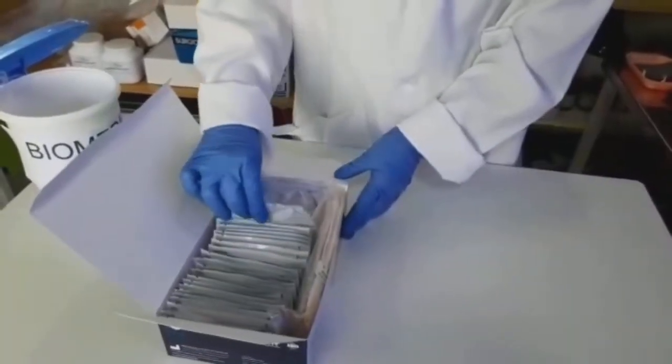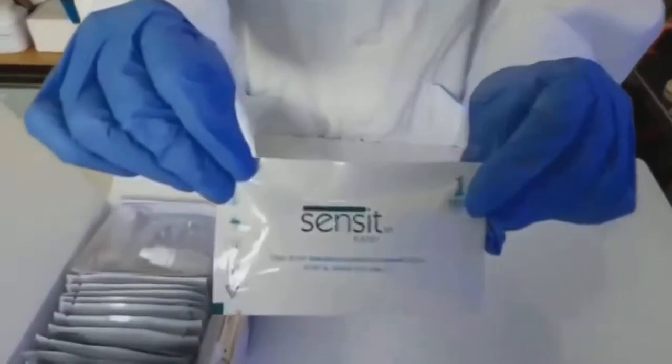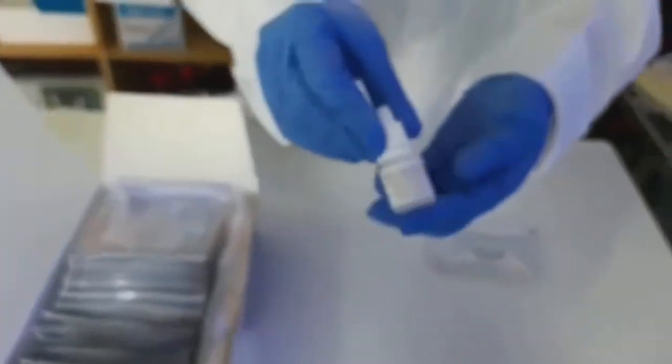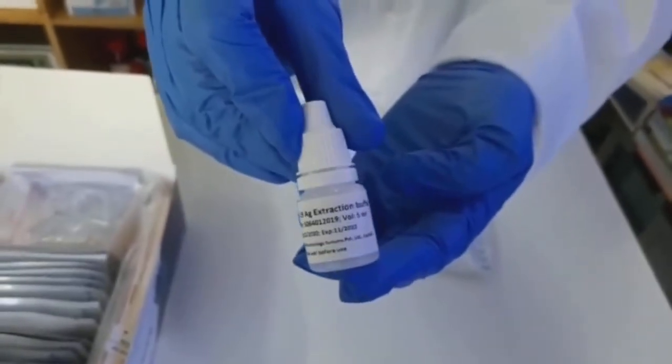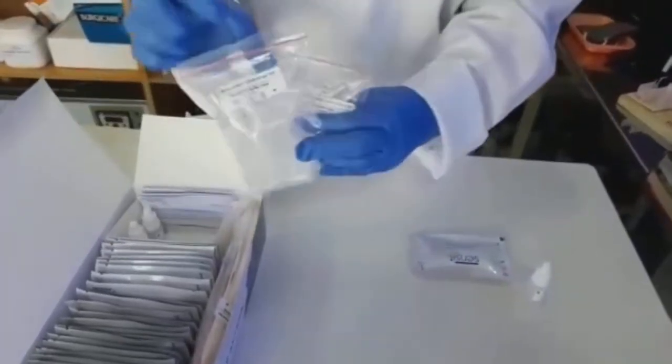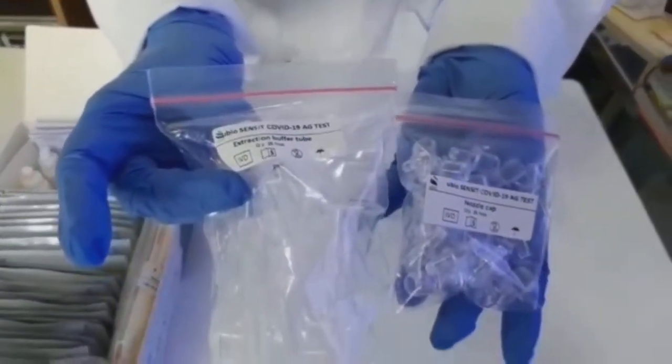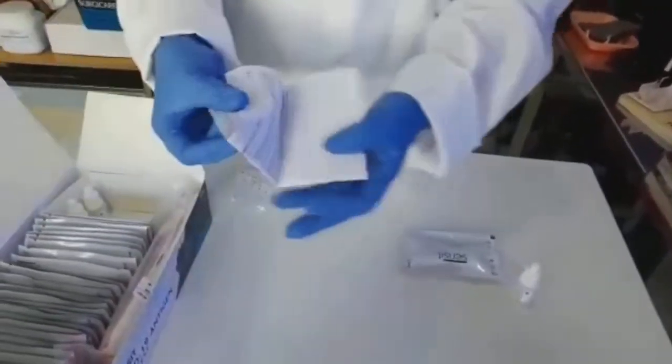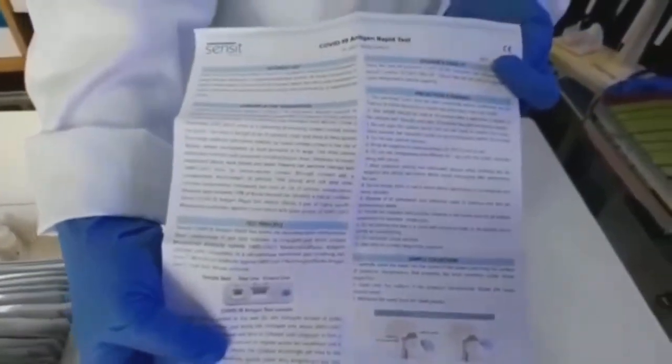The test kit contains COVID-19 antigen test cards in well-sealed foil pouches, extraction buffer and dropper bottles, extraction tube and its nozzles, an instruction leaflet that details how to conduct the procedure, and sterile nasal swabs.